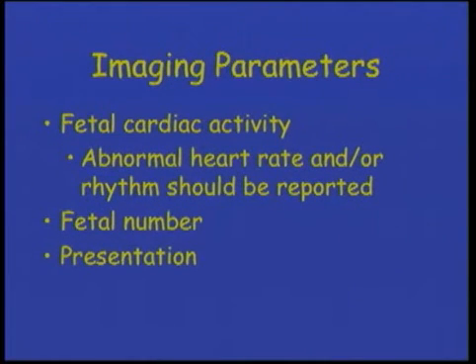We need to look at fetal cardiac activity and notice whether the rate is abnormal and irregular or whether it's normal, and that rhythm should be reported in the report. We need to identify the fetal number again and the presentation.